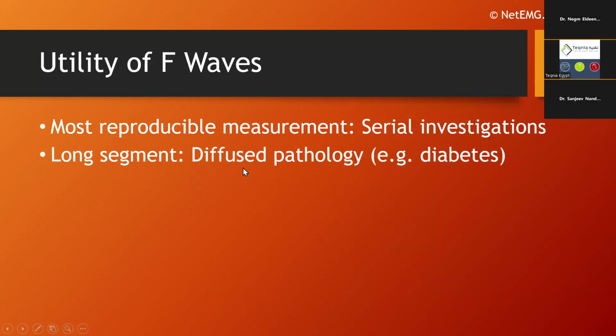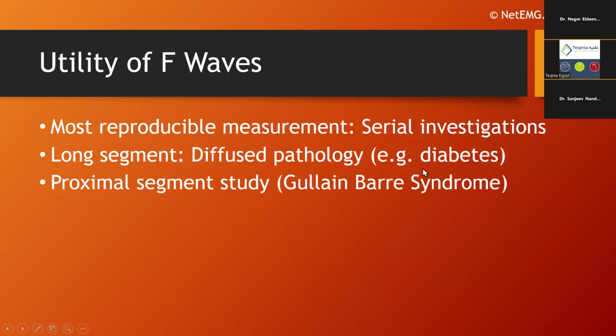They are long segments, so they are useful to study diffuse pathology, for example, diabetes. They are also very useful to study in Guillain-Barré patients because they represent proximal segment study. And as I indicated, this is most useful as a cross-check in nerve conduction and needle EMG.